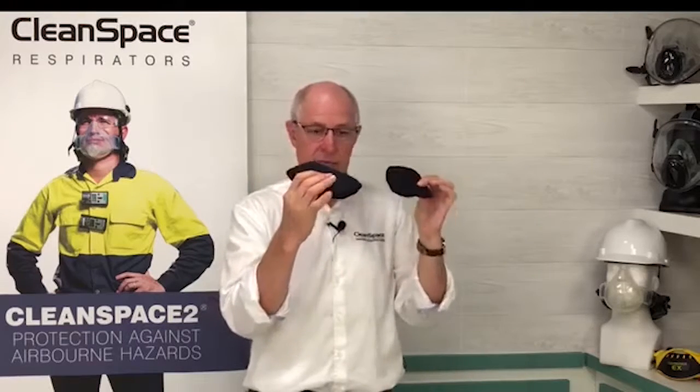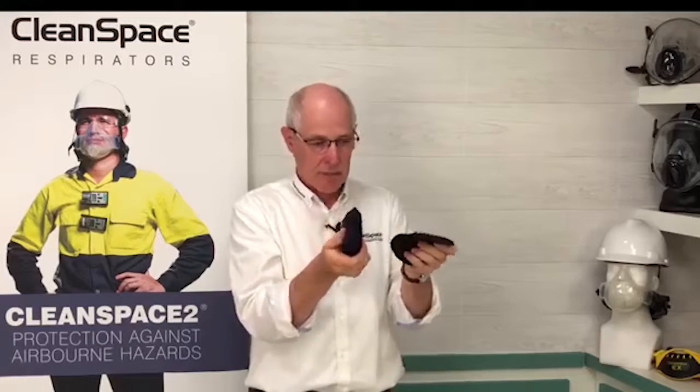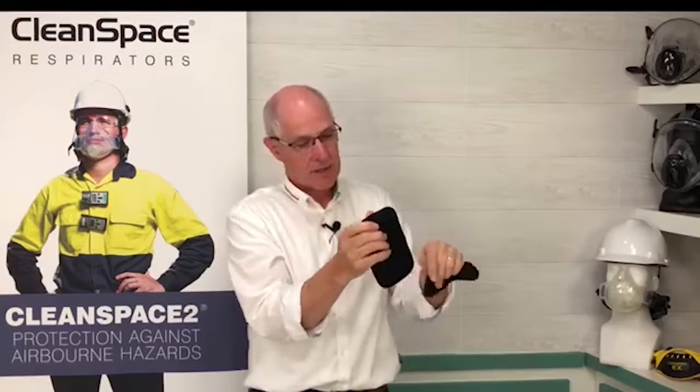Okay. If we have a look at the neck pads, as I mentioned, we have two neck pads available for CleanSpace. We have the thick and we have the thin. Now both of these products are able to be cleaned. So they can be washed, they can be rinsed. The thick neck pad has a foam inner, so that needs to be squeezed out a little bit. But it would typically dry overnight, be dry ready for your shift the next day.